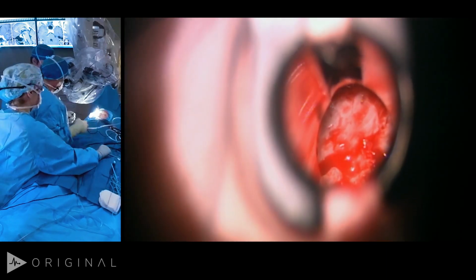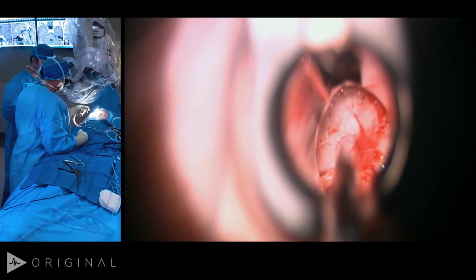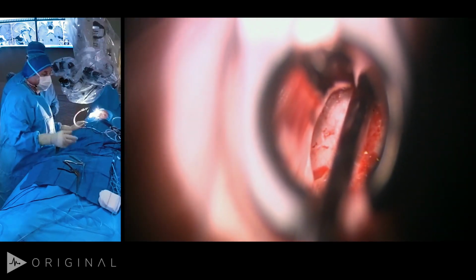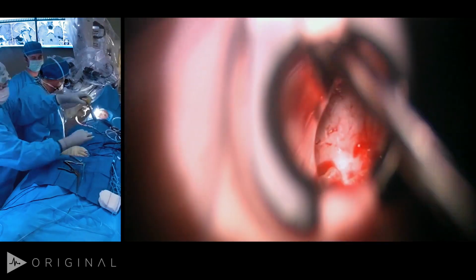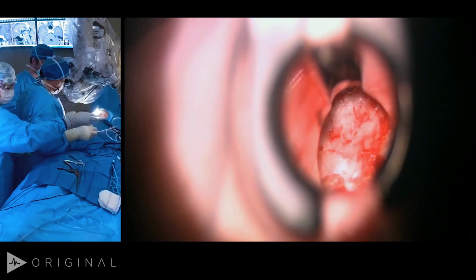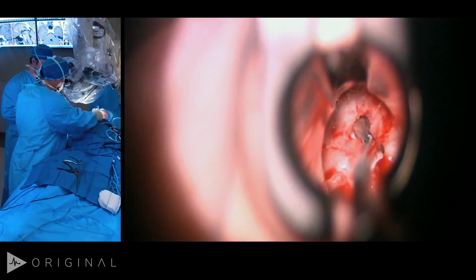So I'm not making great progress here by chipping it off, because her sella floor is a little flat, not terribly convex. So at this point we will use the chisel, a little more barbaric, but certainly effective. And if that doesn't work well, then we'll just go ahead and pull up a drill. I guess what's sort of nice about this is you get to see all different approaches to how to take the sella off. This is old-time neurosurgery, but it works pretty well. It looks like we'll be okay. All we have to do is get a little ledge out so we can get an angled Kerrison in, which I think we're going to do.